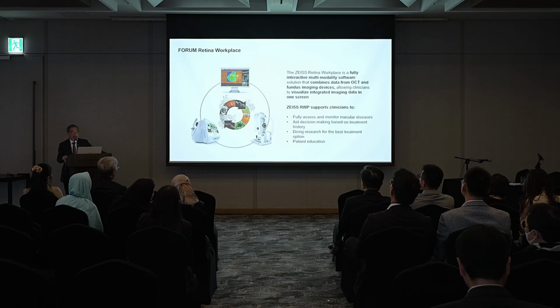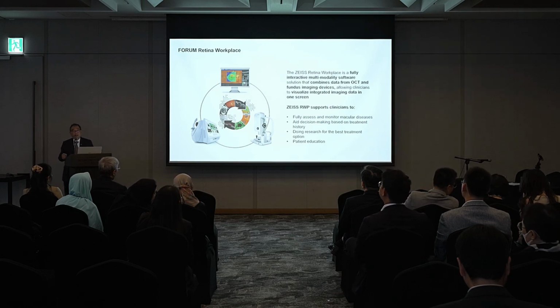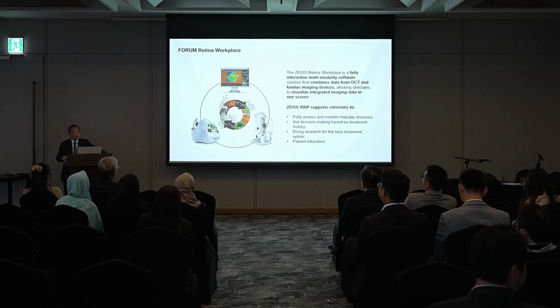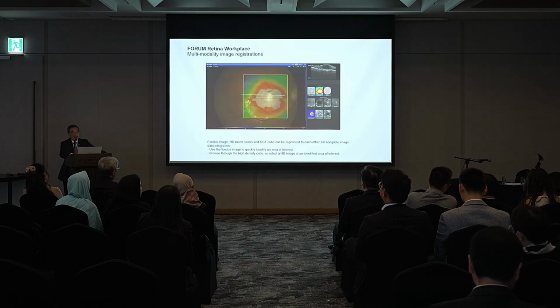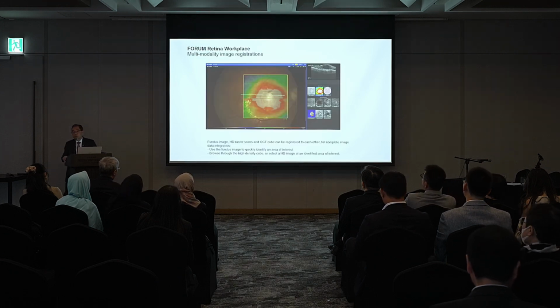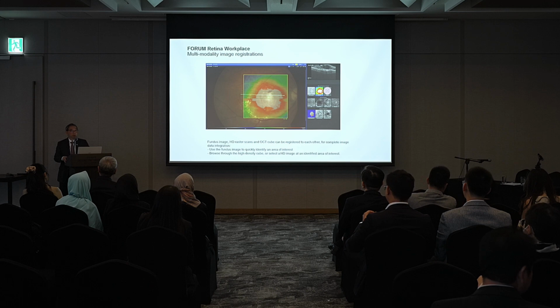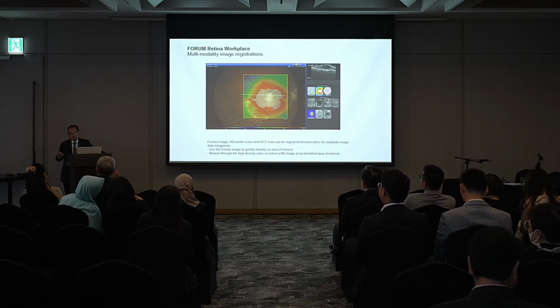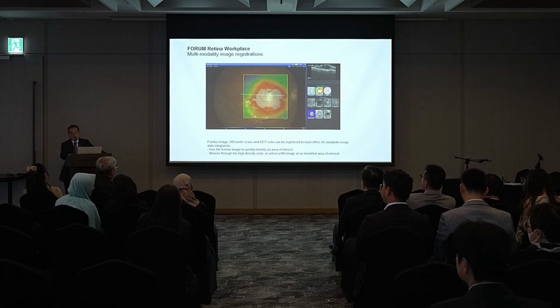Okay? And the Retina Workplace is really targeted at monitoring changes, particularly on the OCT, and now also on the OCT angio. And how I've used it is really not just for diagnosis, but more importantly, to be able to track changes to their macular change with treatment. Many of us are in the era of anti-VEGF treatment. And actually, without imaging, anti-VEGF treatment, I think, would not have taken off in such a meaningful way.